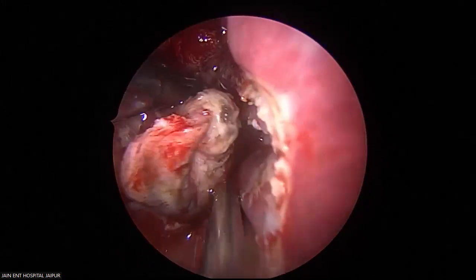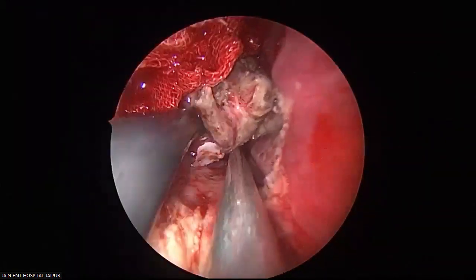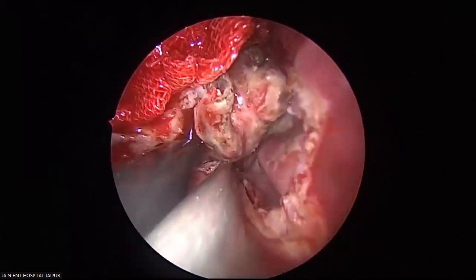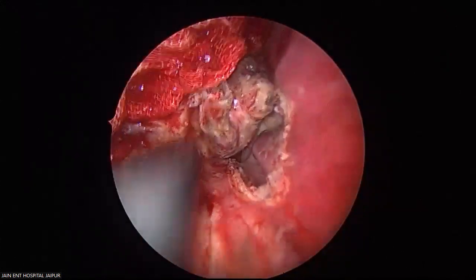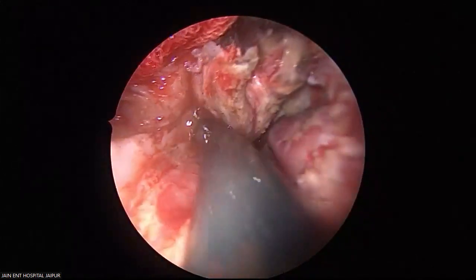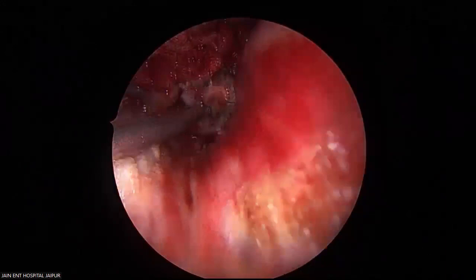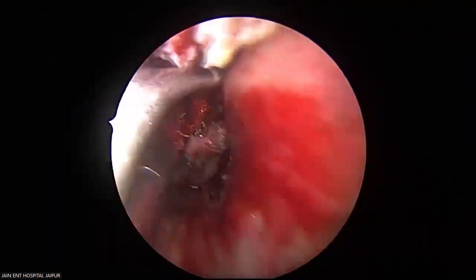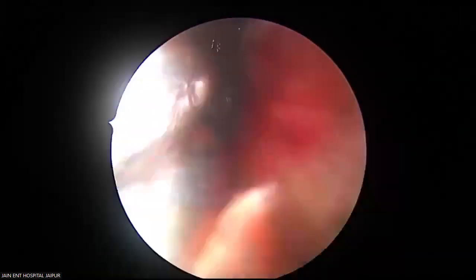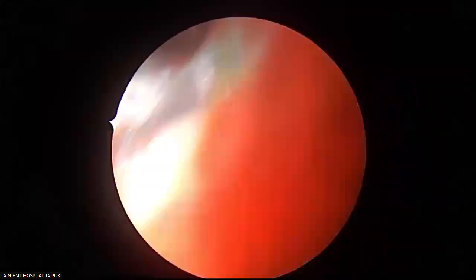Look at the tumor, look now. It was having such an angry look earlier when we started. You remember? Yes, beautifully. We have exposed from all around. Now is a very crucial point to divide it in the midline, at the lateral nasal wall, to remove the medial component. Let me show you.